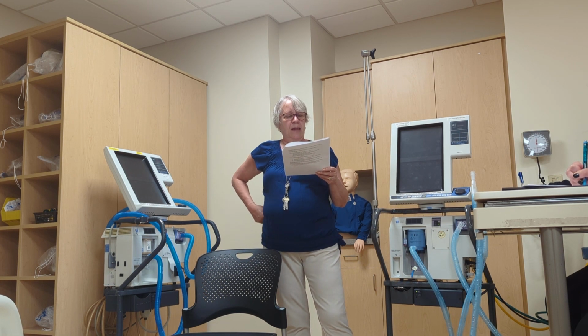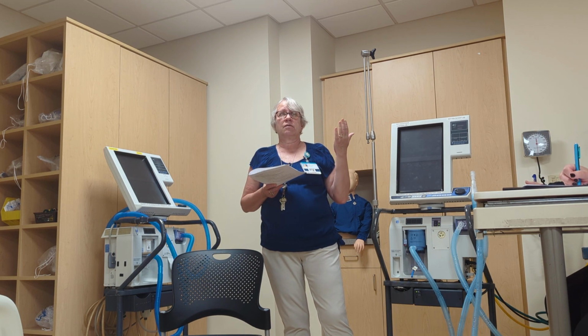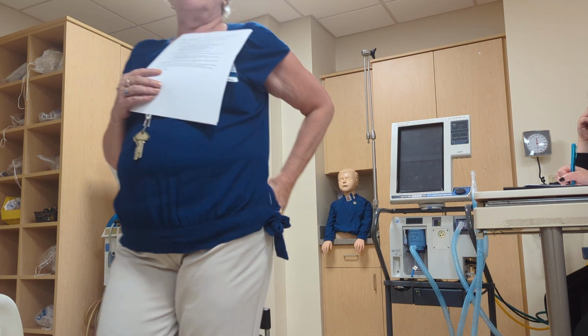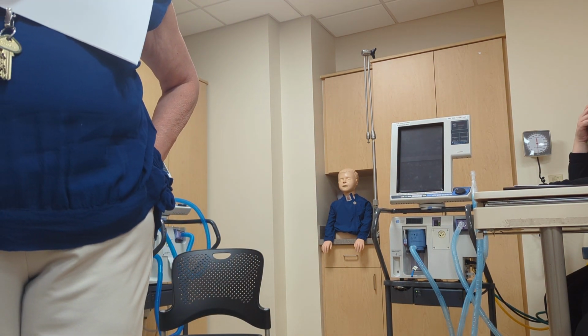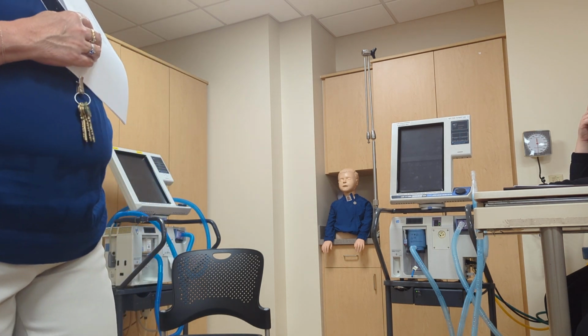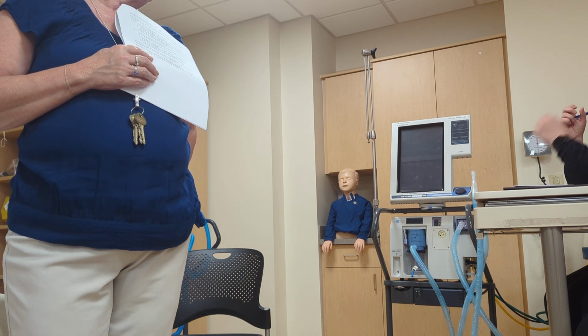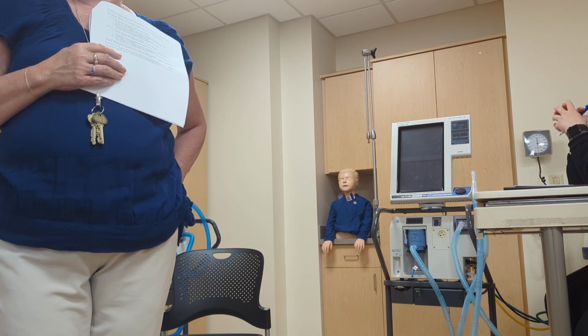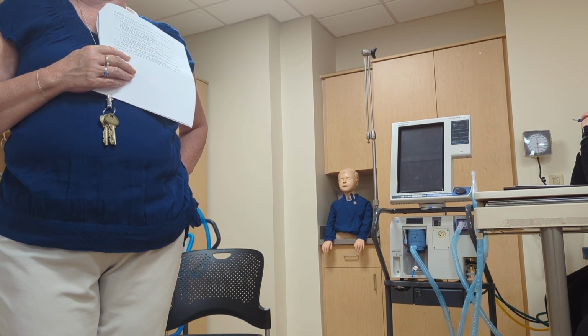Okay? And like I said, we perform the SSTs before you put them on a patient and after you change tubing. I guess I don't know how long a short self-test takes. When you're breaking the circuit, you want it to be fast. Yeah. So if you're gonna change the circuit, it'll take a couple minutes. So you need to have someone else in the room with you to bag the patient. Okay, while you are changing it and running an SST.